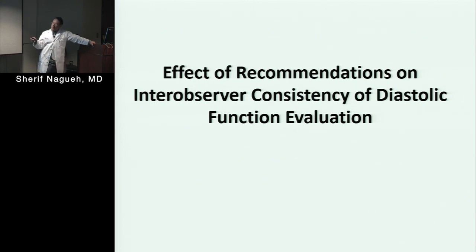When you look at these guidelines, they are very specific. They are calling for how many variables, how many of these are abnormal, and these are the exact values. So you would expect them to get better inter-observer consistency. And we would be able to address that not only among different observers, but also compare that with the filling pressures, because we know whether whoever said it is elevated or not elevated is accurate or inaccurate. And that's also work in progress with other sites.